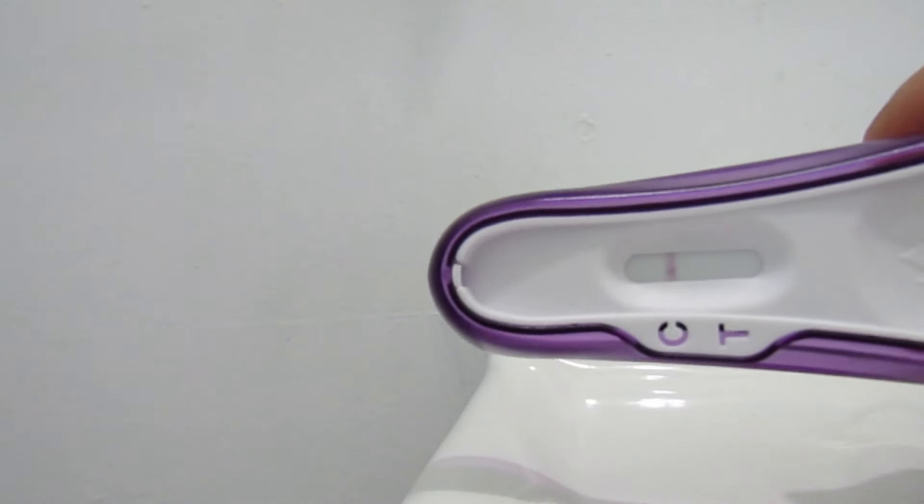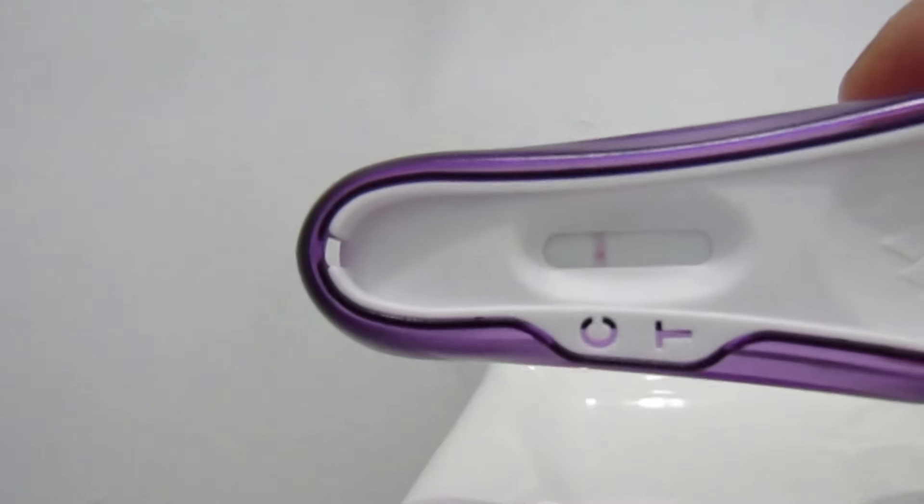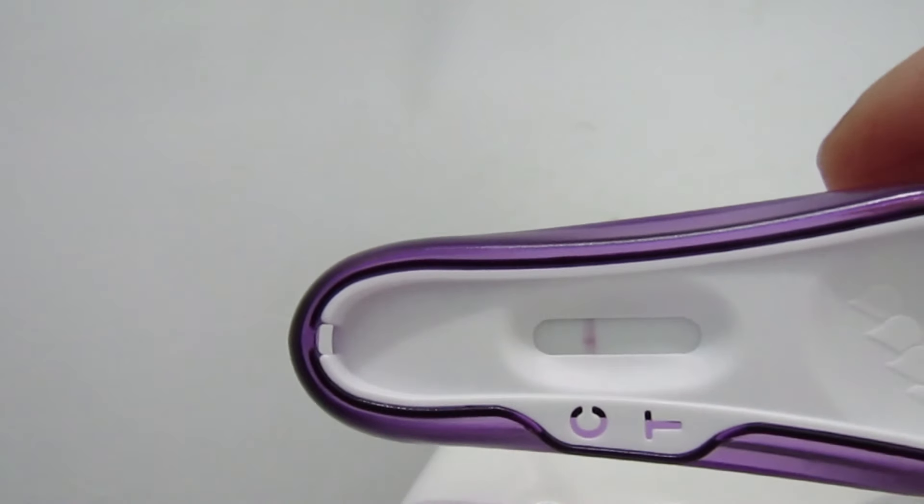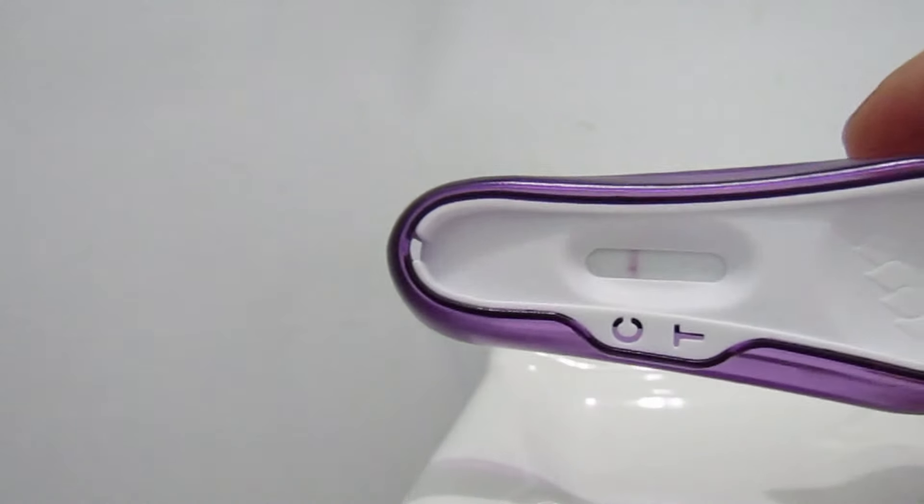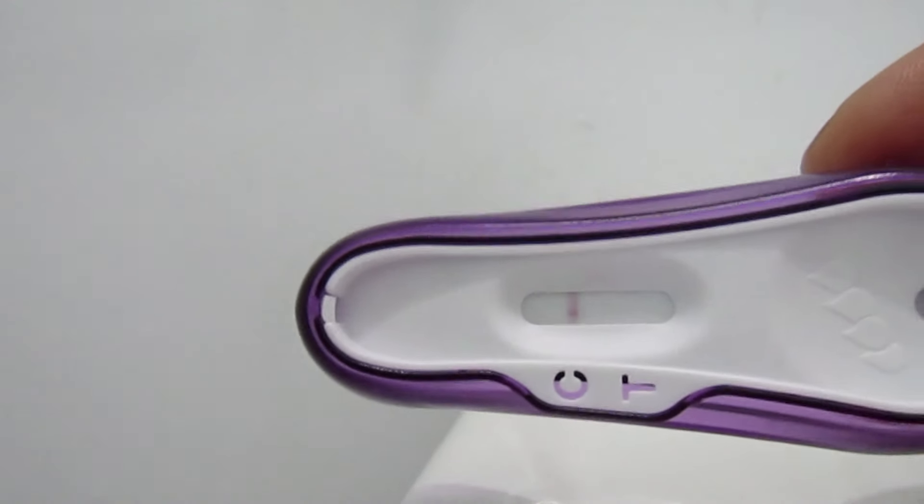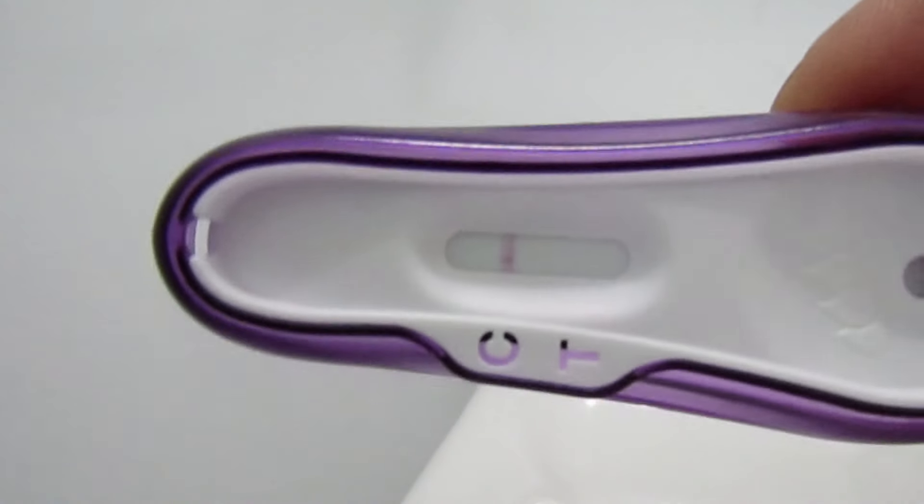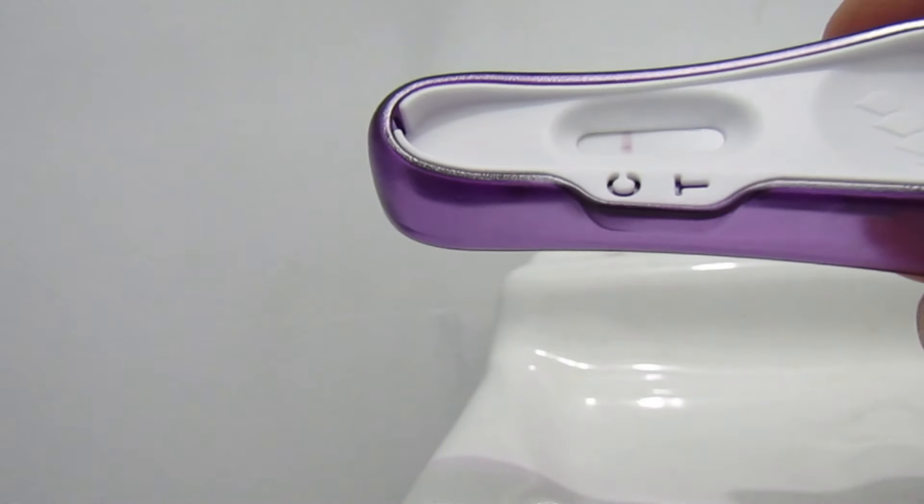So, if all else fails and these tests maybe were beginning to be positive, 13 DPO should definitely give us clear answers because I should be getting some type of a line by then since it's way closer to AF. Usually, I get AF around 14 DPO. So, I think that's what we'll do. I don't think I'll take a test for tomorrow.